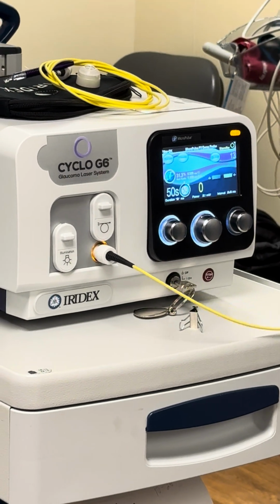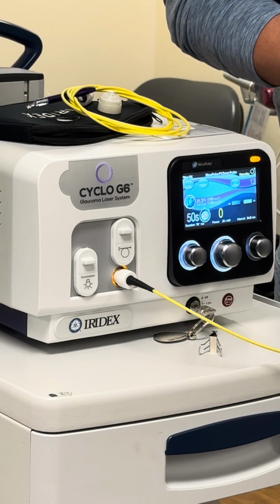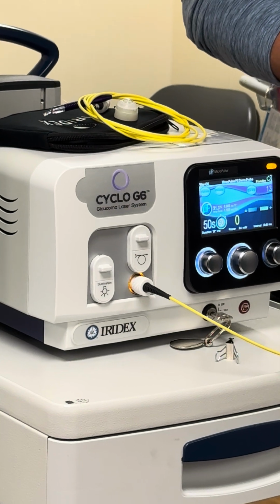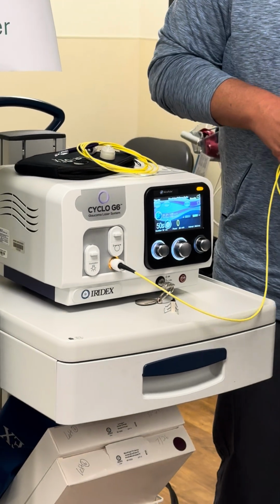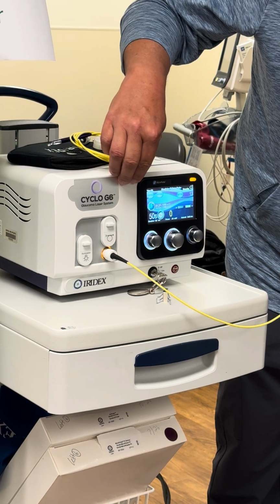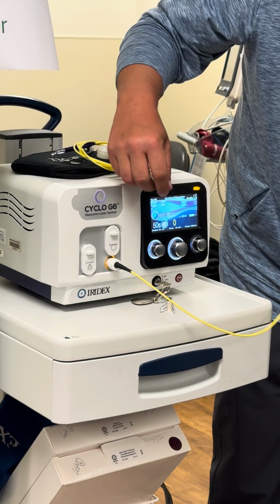So this system doesn't have the latest software. The latest software is set up for 5-second increments, so they could do 5 15-second sweeps per quadrant. This one, it's got 50 seconds, so that's 5 10-second sweeps.